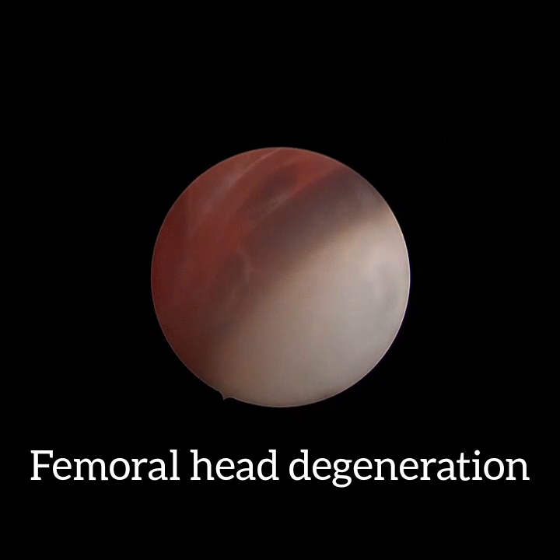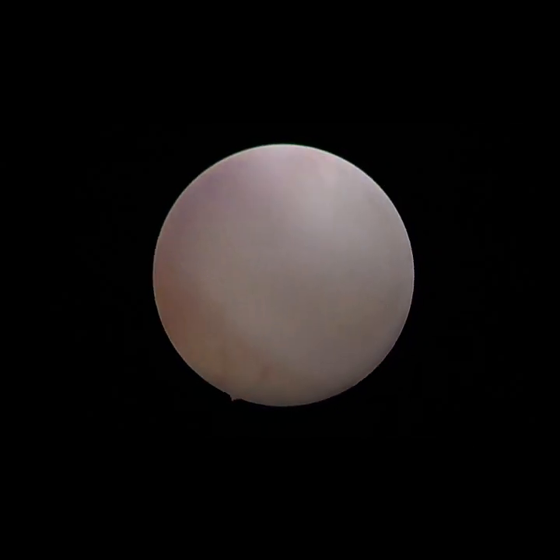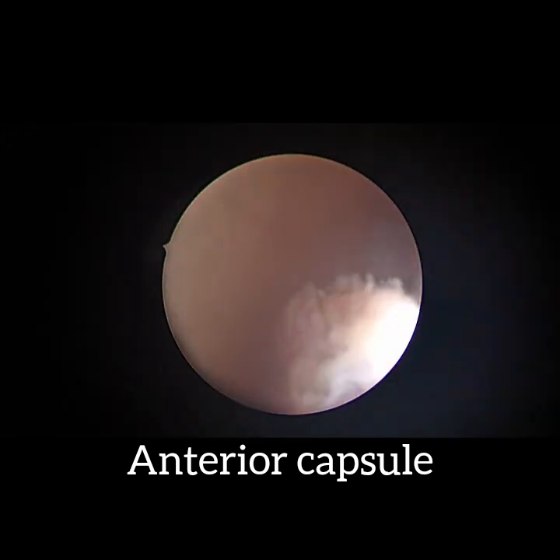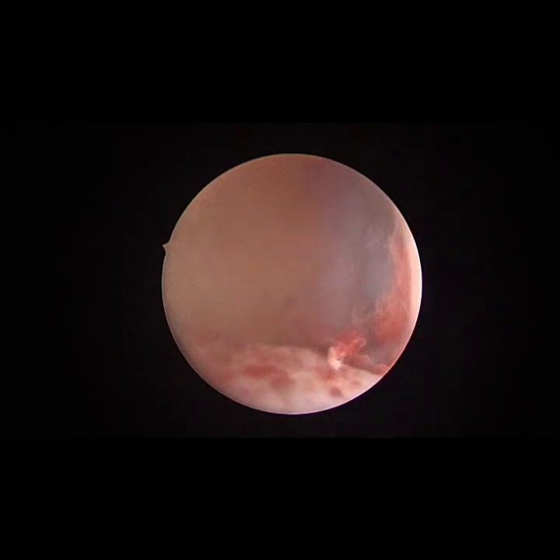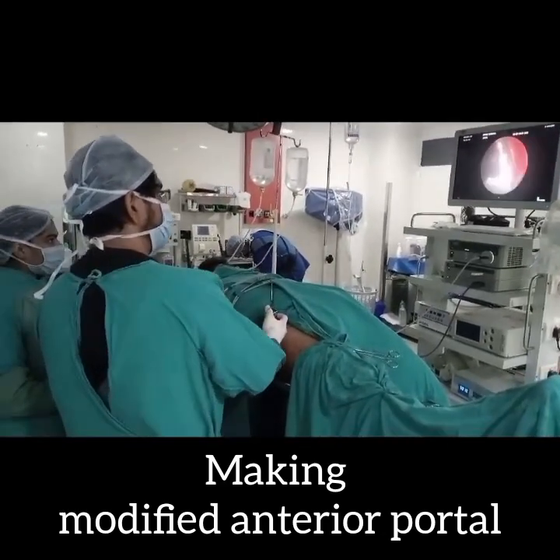Moving our scope superiorly, we can see the femoral head curvature to see any pincer or cam lesion. This is the anterior capsule which we are seeing, and now we are back into the hip joint. Below is the acetabulum. Now to take the biopsy, we have to take the modified anterior portal.